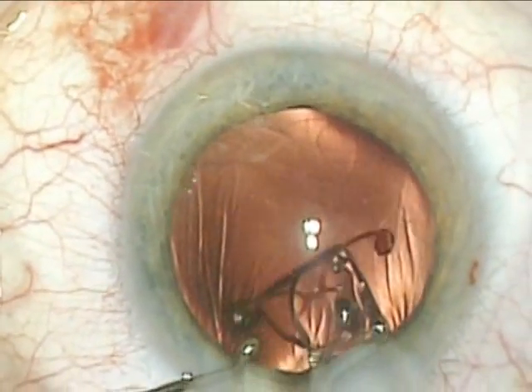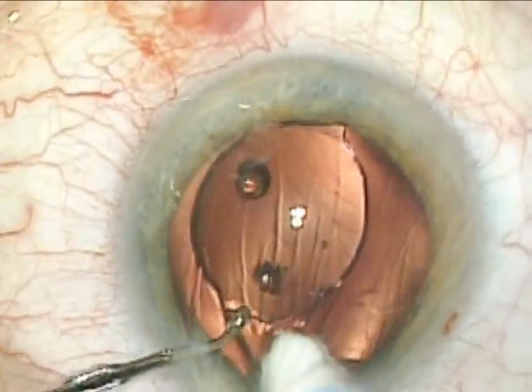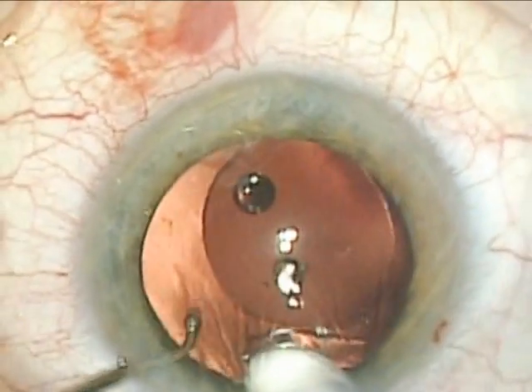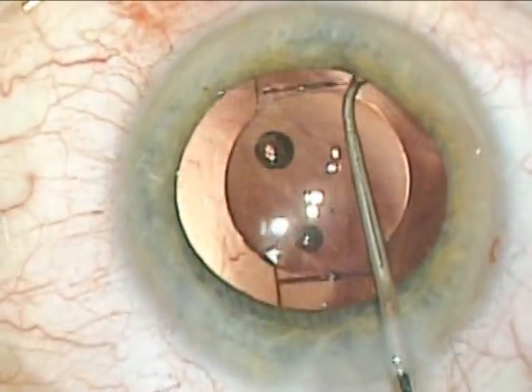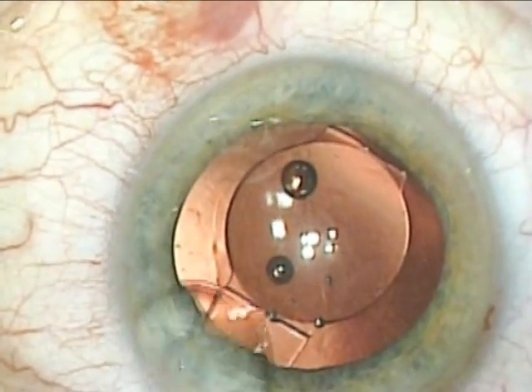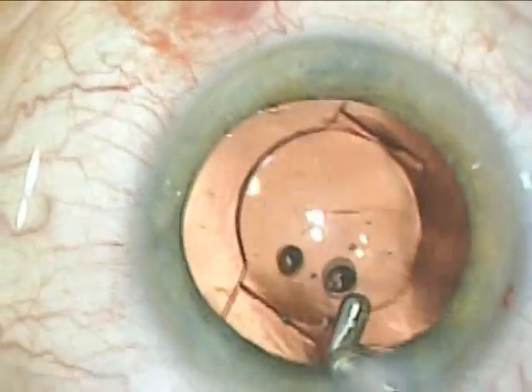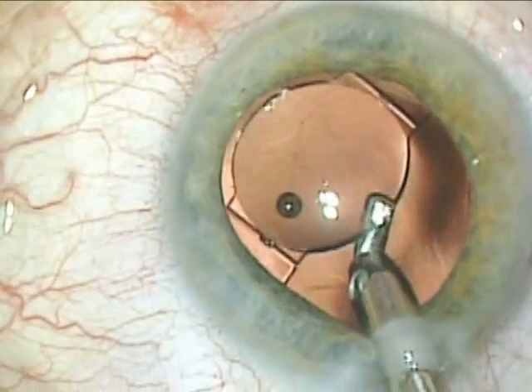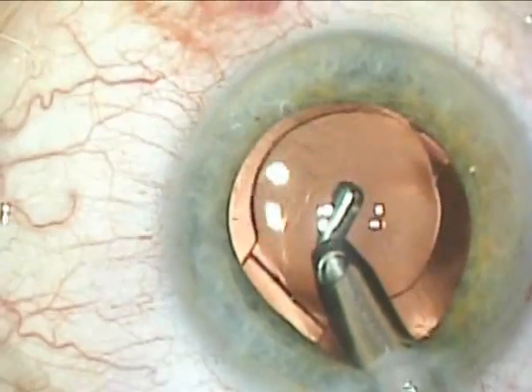I begin to inject the lens with the cartridge. You can do this as a one-step technique by positioning the trailing haptic as it comes out of the injector into the capsular bag. I then move the lens into position and perform irrigation aspiration to remove the viscoelastic both behind the lens and in front of the lens. I hope that you found this video useful and that you will enjoy inserting the Crystalline 5.0.